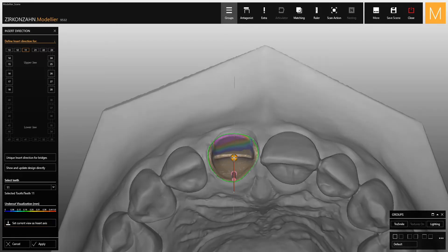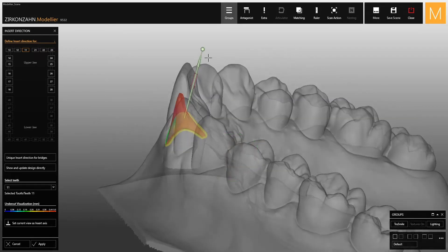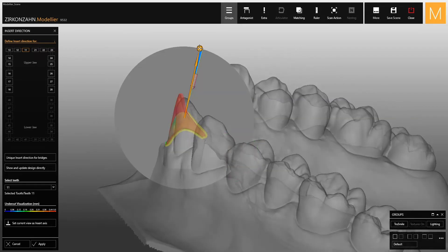If you use the second method, when you move the arrow, the software allows you to view the model from different directions.